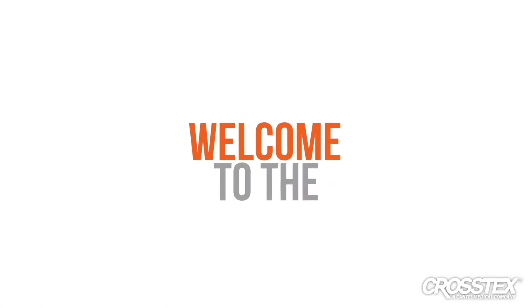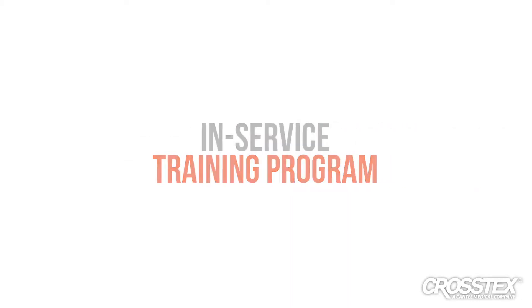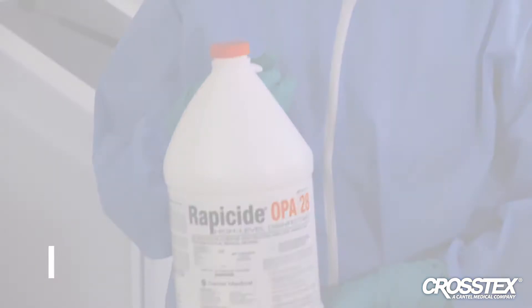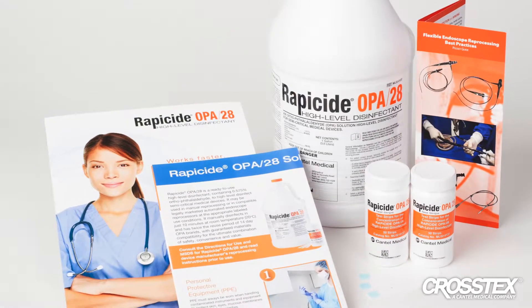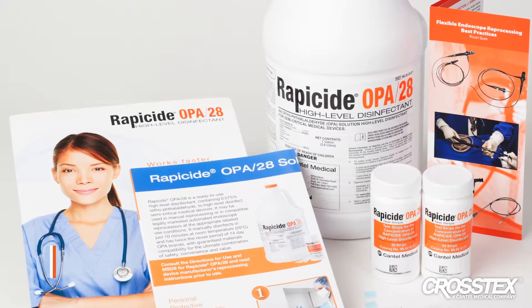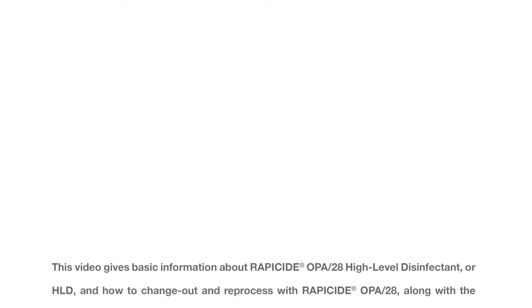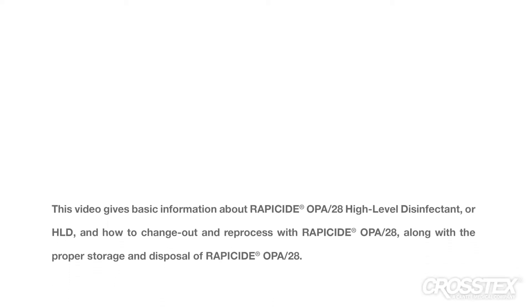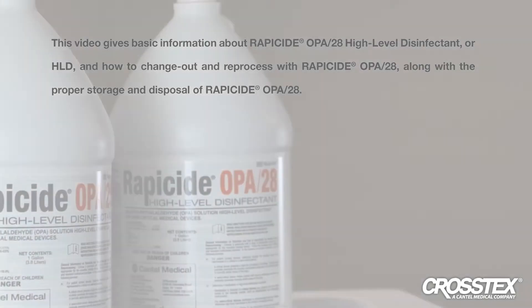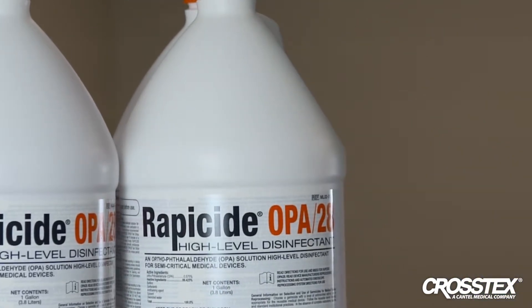Welcome to the Rapicide OPA/28 high-level disinfectant in-service training program. Crosstex has developed this program to help you learn how to use Rapicide OPA/28 high-level disinfectant when reprocessing flexible endoscopes, either manually or in automated endoscope reprocessors, also known as AERs. This video gives basic information about Rapicide OPA/28 HLD and how to change out and reprocess with it, along with proper storage and disposal.